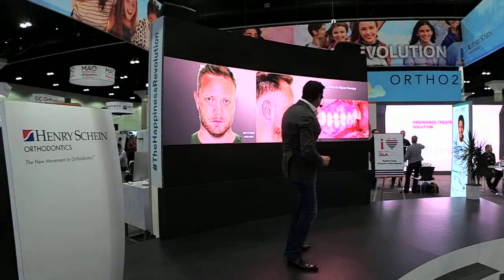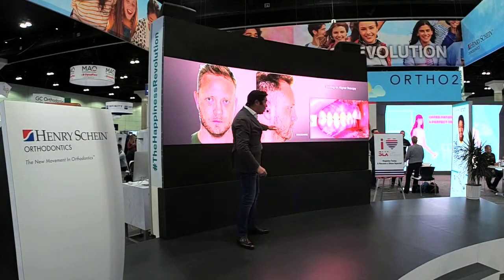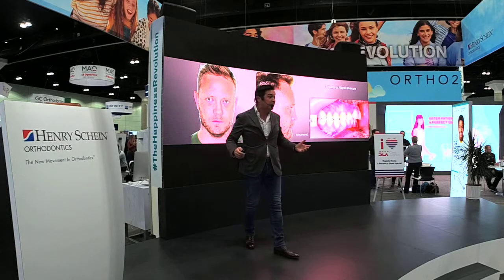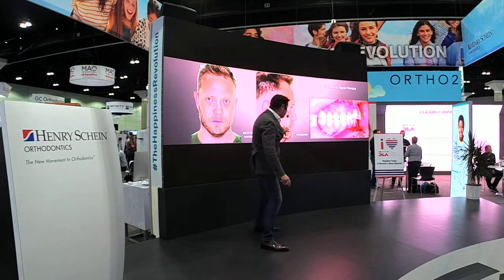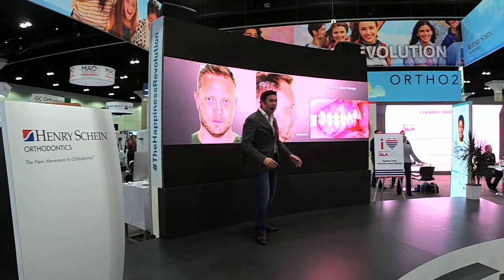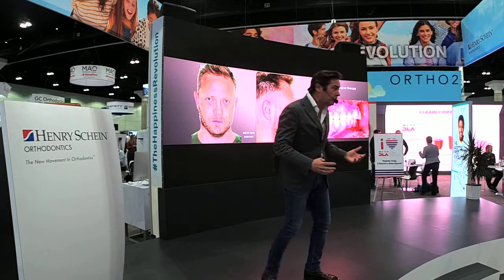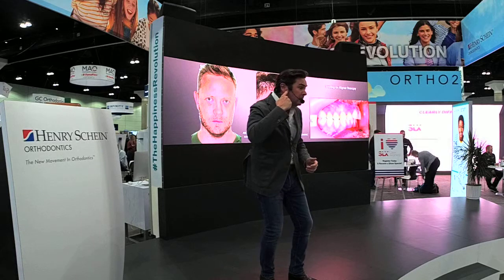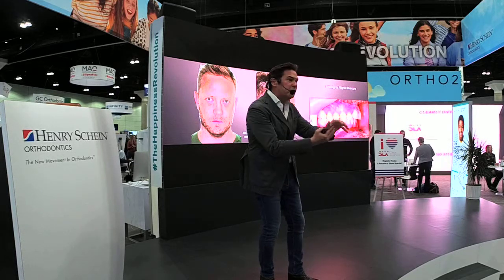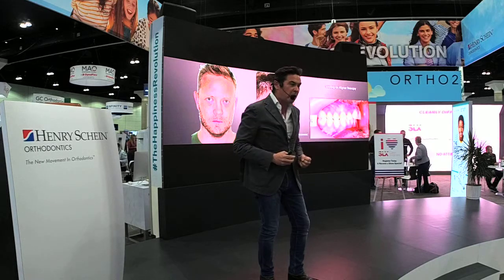Imagine that we have a case like this, an adult patient, 40 years old, 39 years old, coming to the office asking for aligners. We have a patient asking for aligners with this retrusion. A retrusive mandible, 40 years old, has no capacity of growth, because at 40 years old we do not grow. At the same time, we have a patient that is having pain and clicking and obstructed airways. So how can we help with an obstructed airway?